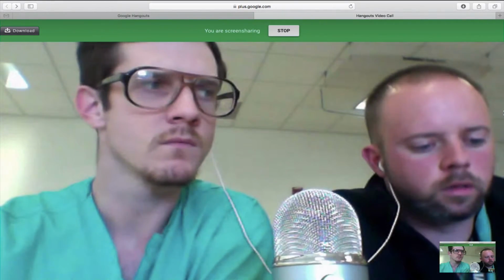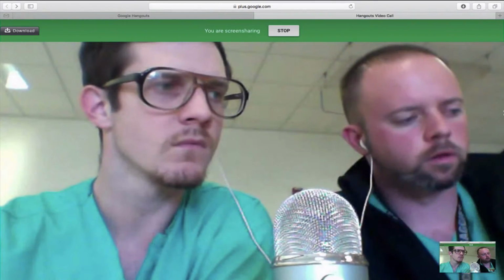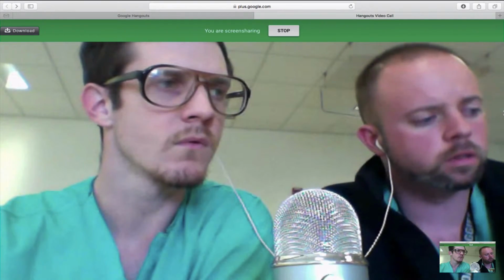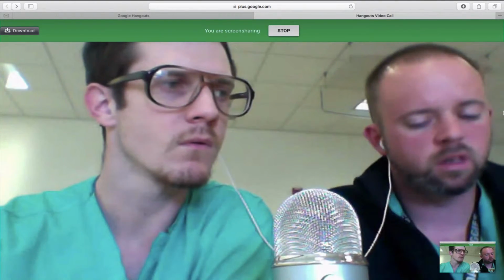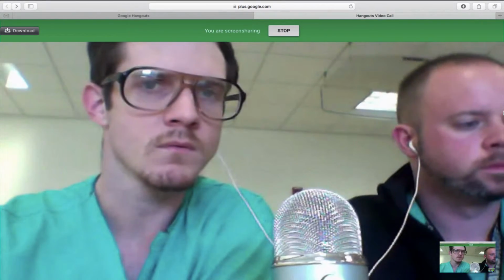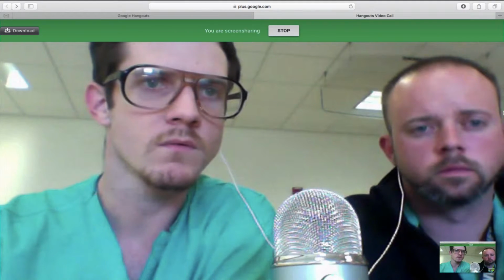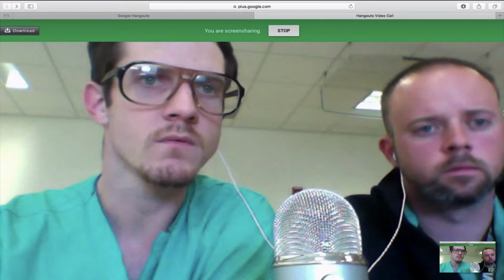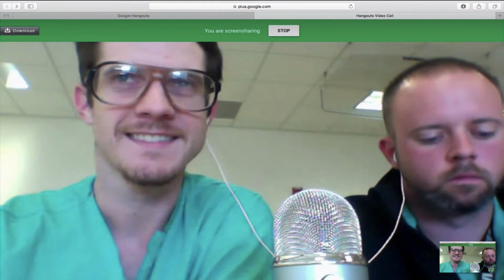As far as causes of increased optic nerve sheath, I just did a quick search. I feel like a lot of them are going to be related to the causes of papilledema, which a lot of those are pretty scary as well. So either way, it's a good test to at least pick up on things. Yeah, I think that we could all use work on our ophthalmologic exams, and there's a nice study out there that even internal medicine docs that have been using their ophthalmoscope for many years still can't do it accurately.